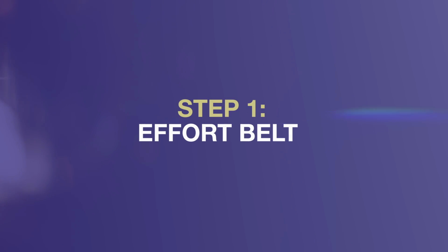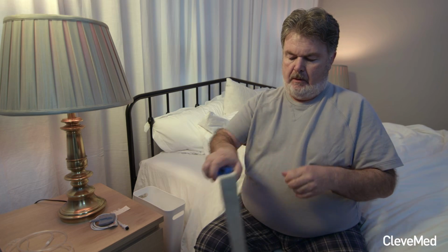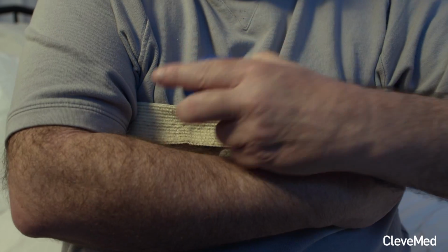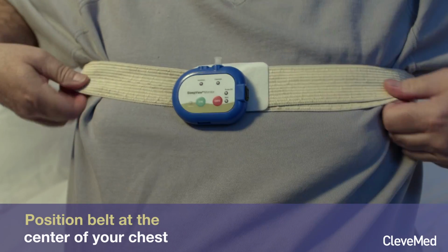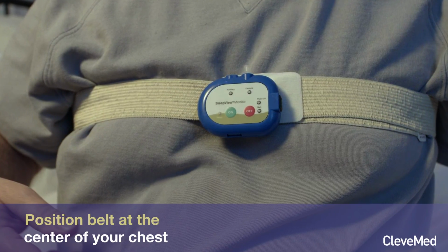First, snap the effort belt to the SleepView Monitor, ensuring that you hear both snaps click onto the belt. Wrap the belt around you and use the Velcro tabs to secure the belt snugly but comfortably. Adjust the belt so that SleepView is positioned at the center of your chest, above your breast.